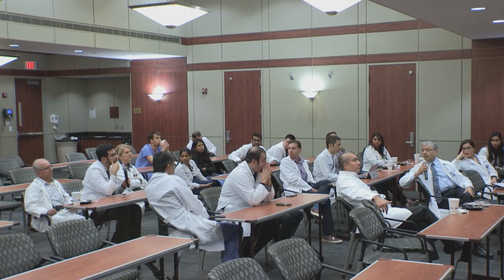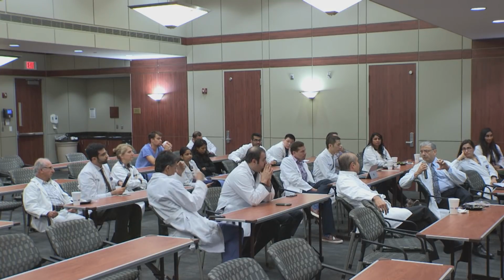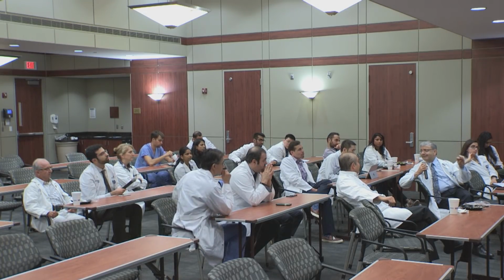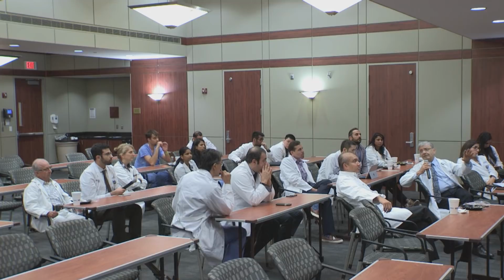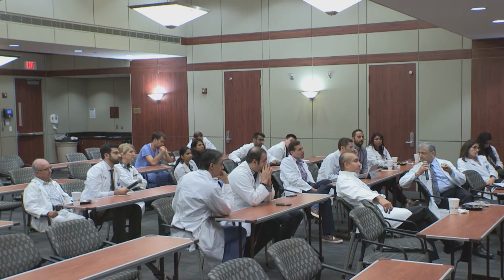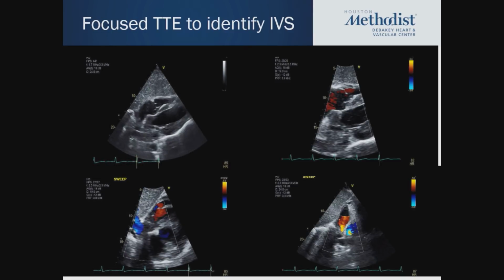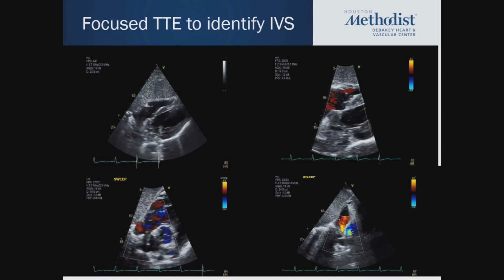That's why I'm still so confused about this. Remember, if you have what looks like a pouch or a pseudoaneurysm from a chamber that doesn't communicate with another chamber, it's not a pass-through going somewhere else. The pressure is identical to your major chamber, so in this situation the pressure is identical to the LV. Now you may see, if this pouch empties, like a pseudoaneurysm of the mitral-aortic intervalvular fibrosa, that it fills again with a little tiny jet that is not high velocity, and it lasts just a few milliseconds and will stop.